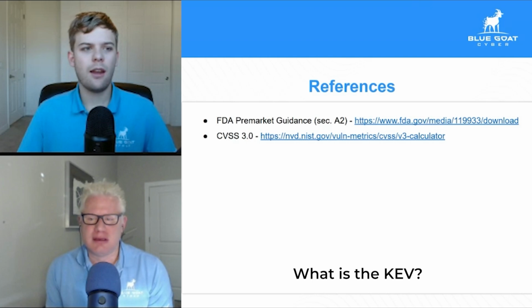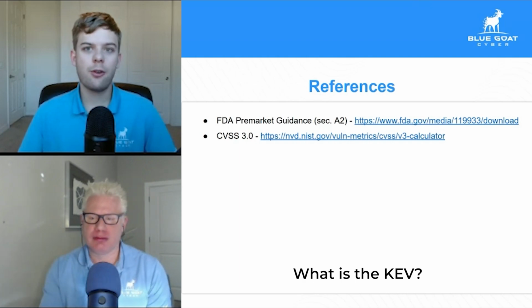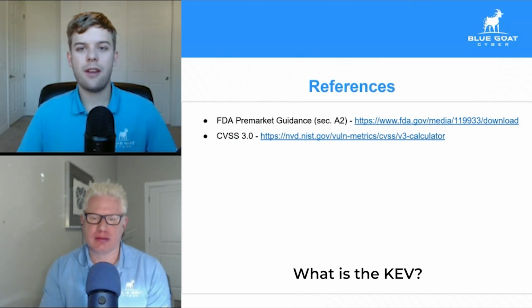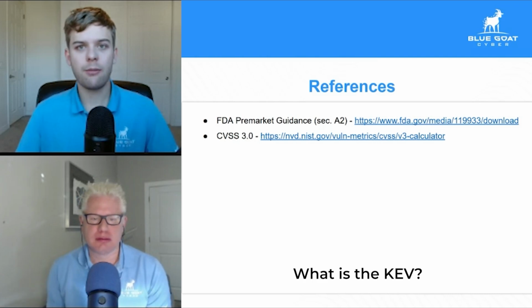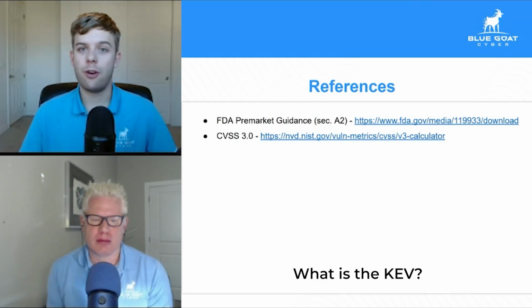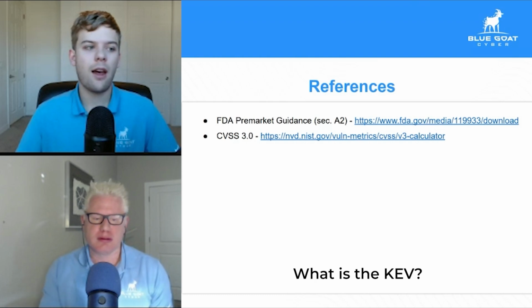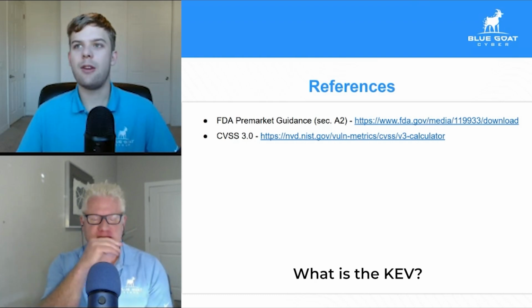That have actually been exploited. And so a known exploited vulnerability is something with public exploit code that threat actors exploit commonly in the wild. There's a lot of traffic for it. A lot of people know how to do it. Where a lot of vulnerabilities, a lot of CVEs that come up, they're disclosed to the manufacturer by a security researcher and fixed without anyone ever knowing how the vulnerability works or what's going on there. So those are of less concern since it would effectively take someone reverse engineering the component to understand what that vulnerability looks like.